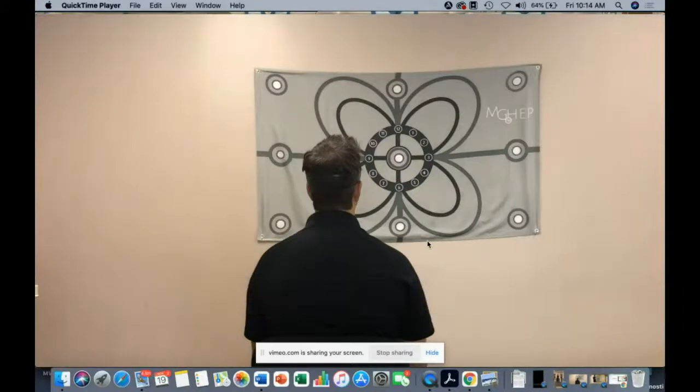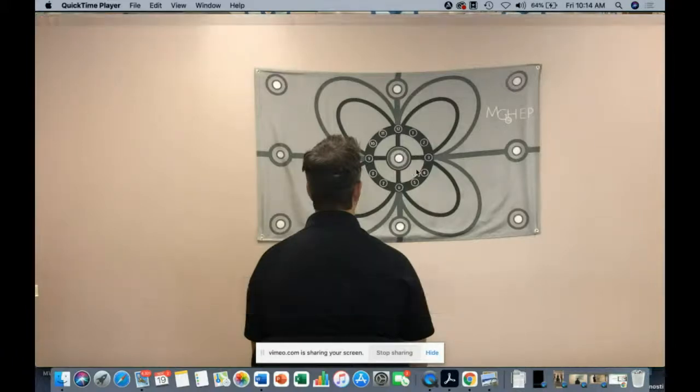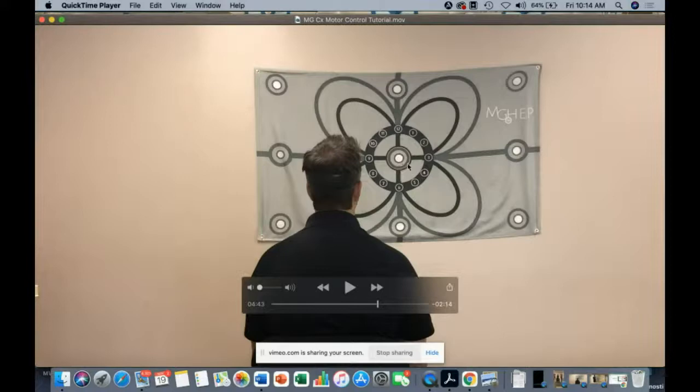So what would that look like if it was dysfunctional? Typically we see the single side dysfunction or a hypotonic side, so if I have them look toward the right target, the laser would follow that target. So that would move over toward the 3 as they moved here. As they moved to the left, it probably wouldn't move at all, or vice versa. If they had a dysfunction moving down to the right, they'd move their eyes down here and the laser would follow their eyes. And so the laser allows us to learn where their pattern is not pure, and therefore they can get feedback on how they're doing without having to use expensive software or something like that.